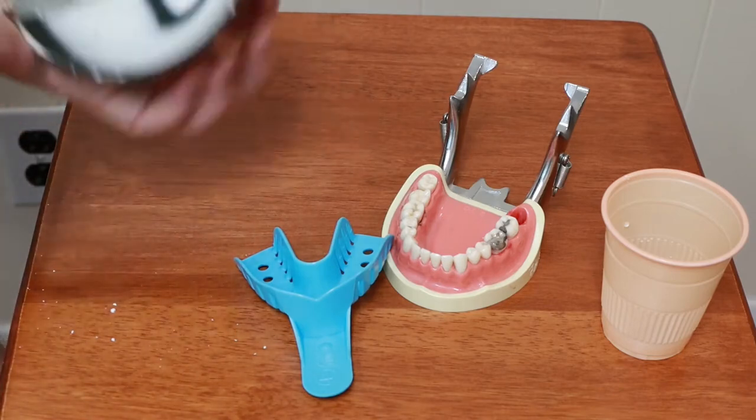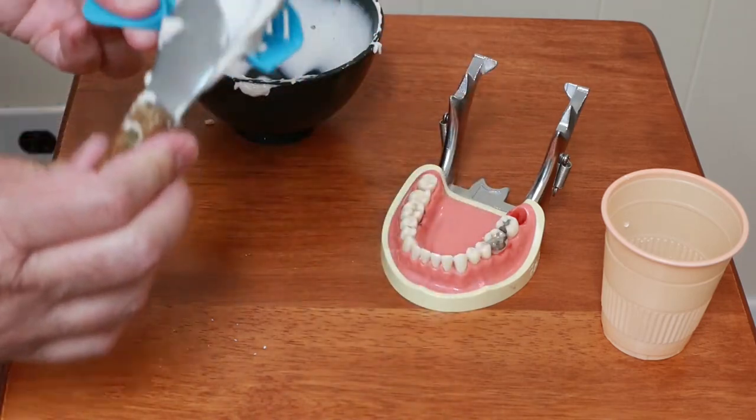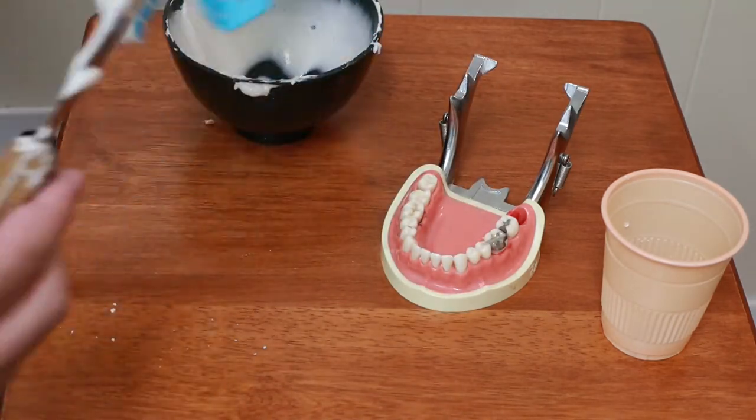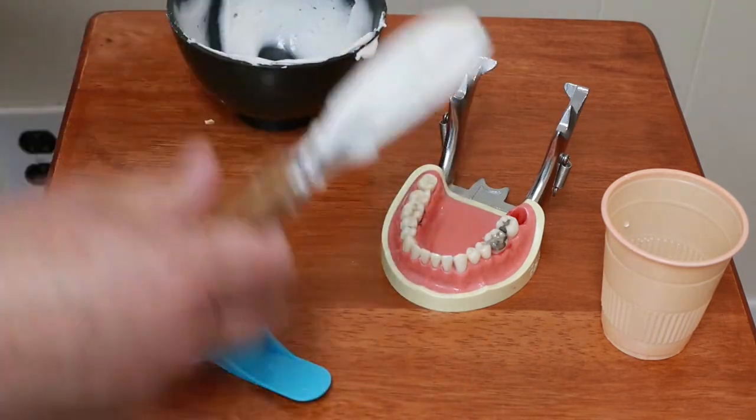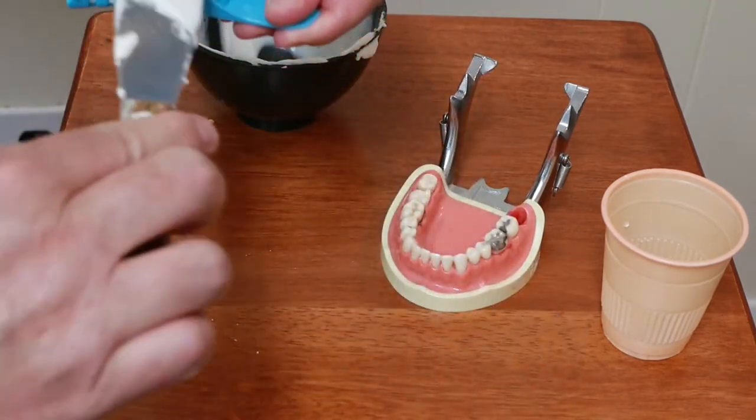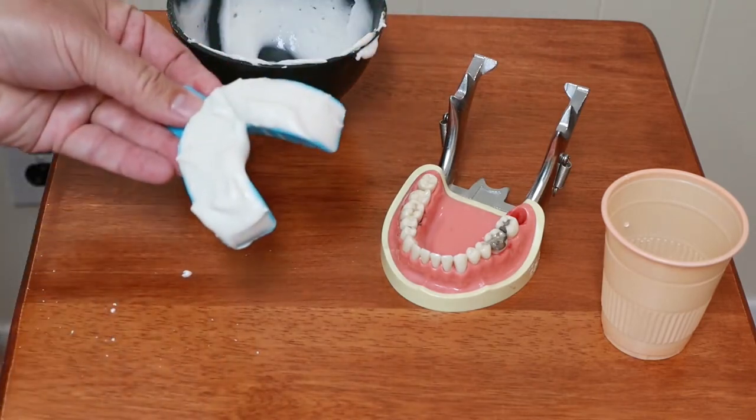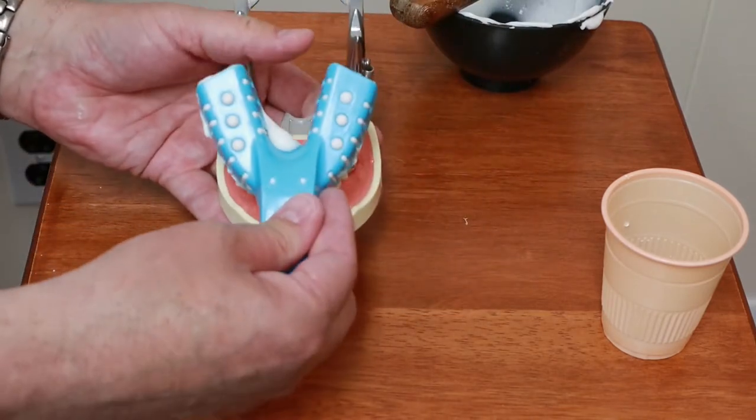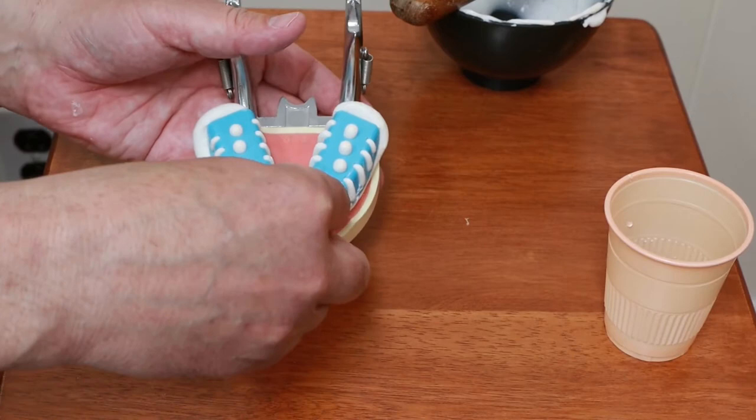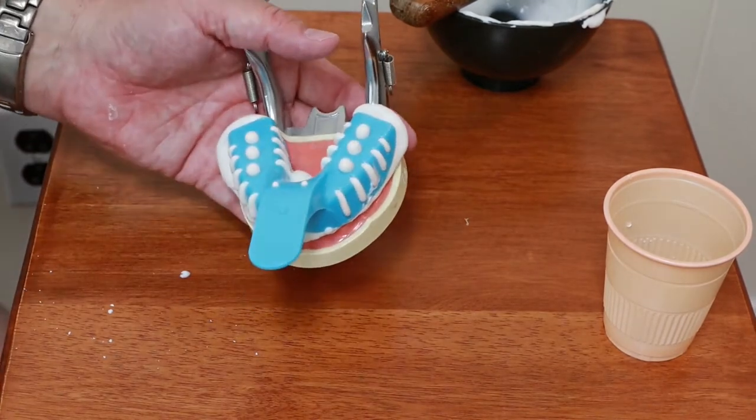Once it's mixed then I'll just load it up onto my spatula and load the impression tray. And then we take the mold of the lower teeth. And again we just give that a couple of minutes to set up.